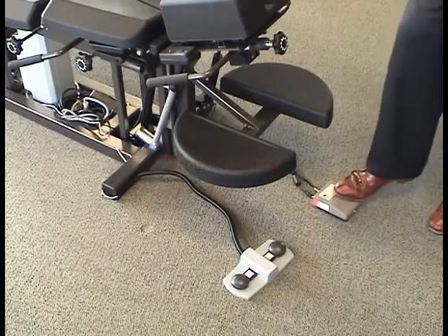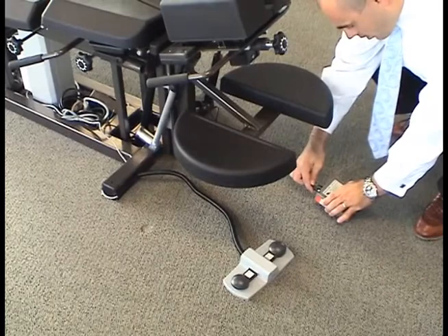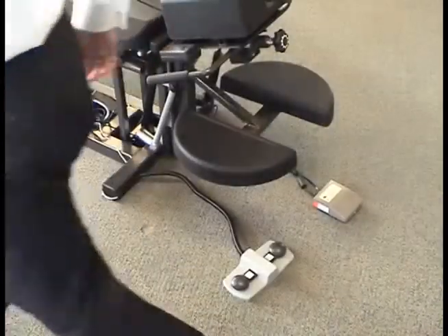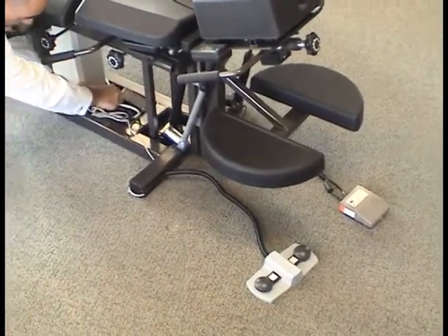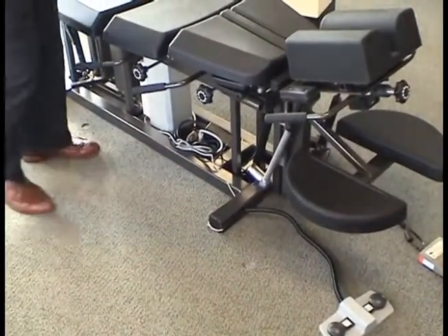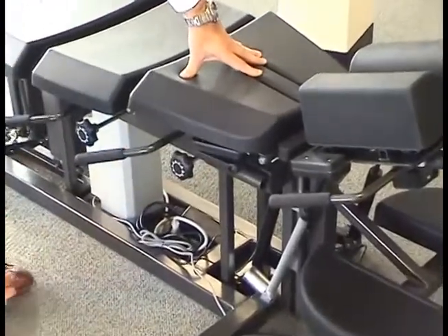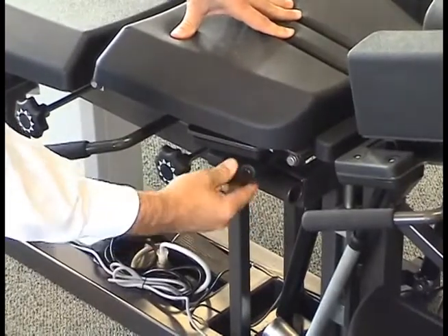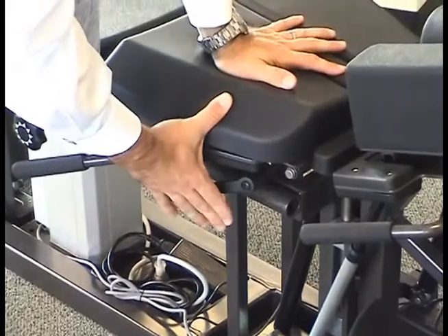Troubleshooting points. The headpiece will not elevate. Check all the plugs relating to the foot switch and the motor. The table will not elevate. Check the plug related to the elevation motor. A section of the table will not elevate or angle. Check the position of the black cylinder release lever and make sure it is set to accommodate sufficient travel and ensure proper cylinder engagement.